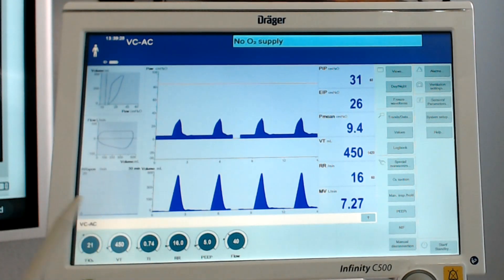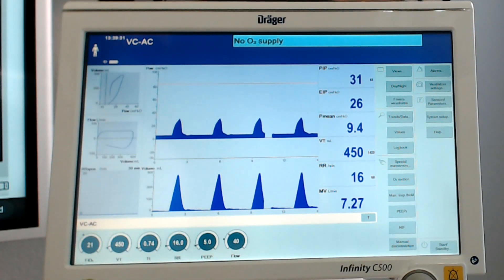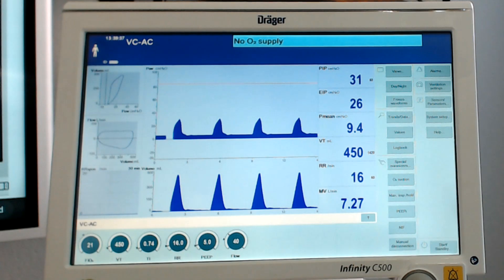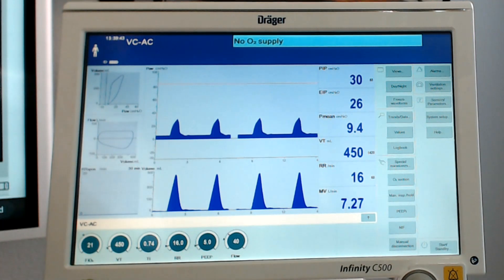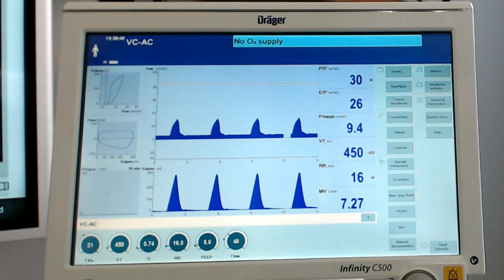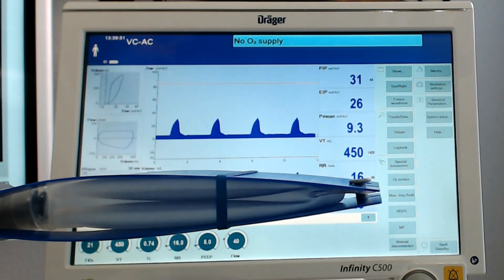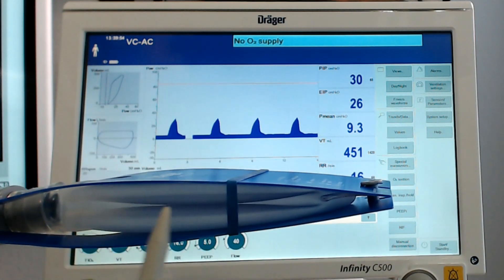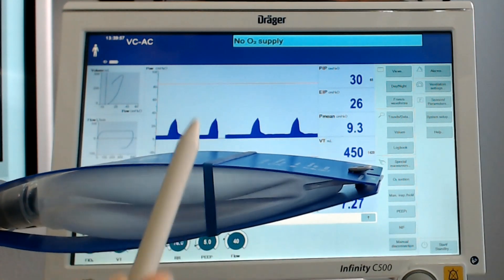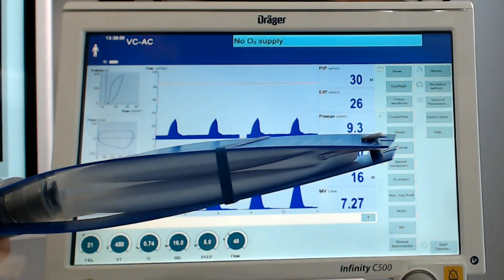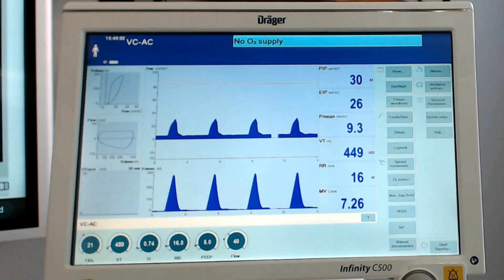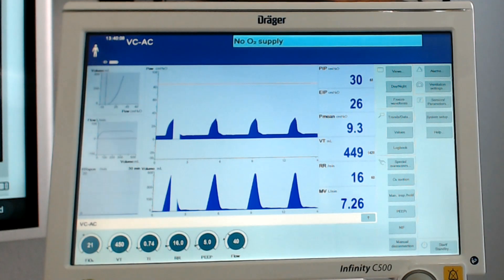Now we're going to illustrate the effects that compliance and resistance have on your parameters — meaning how much volume are we putting in, what happens to pressure when we put that volume in, and how compliance and resistance affect that. I have a test lung here with one rubber band around it. This is our starting point so I can show you a decrease in compliance, an increase in compliance, as well as a change in airway resistance.